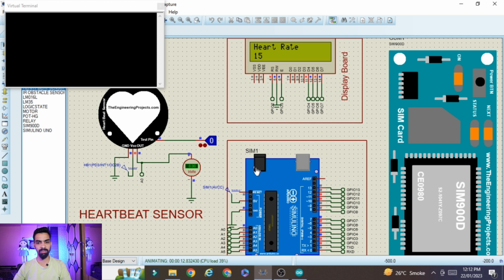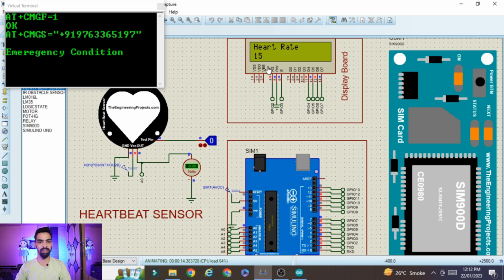Now wait for some seconds. Now it will send the message because count is below 30. So you can see again emergency condition message sent. So this is the second part. Now we will see what will happen in normal condition.